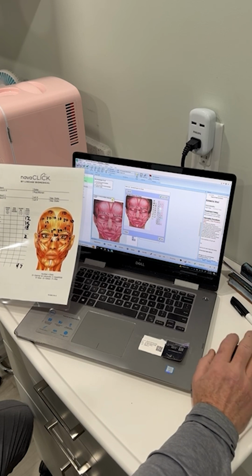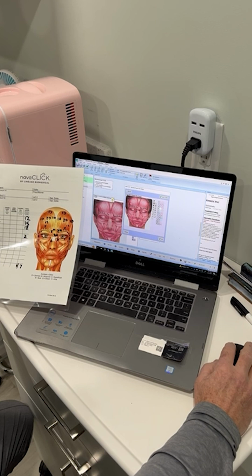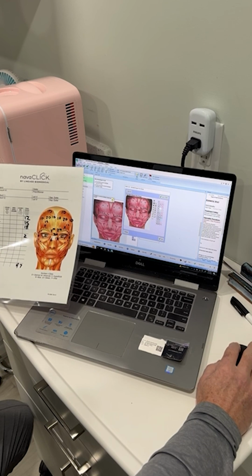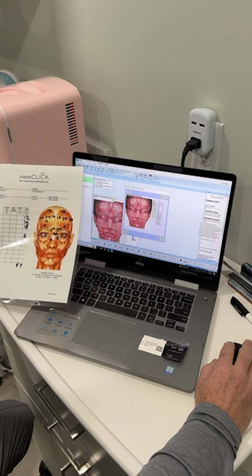Now, I did some dermals on my forehead, so I'm going to just scoot right up there and do 1 dermal here, 1 dermal here, 1 dermal there, 1 dermal, 1 dermal, 1 dermal. Then I have 2 all of these in the dermis because I don't want my brow to drop. And then to keep that freaky little crease that comes over the brow a little bit, I'm going to go really superficial right here, but not enough to weaken the muscle significantly.